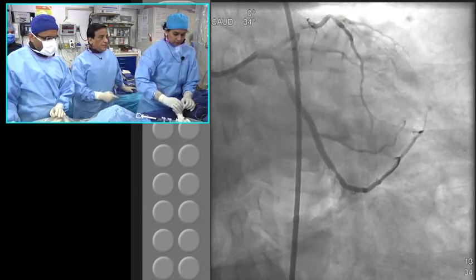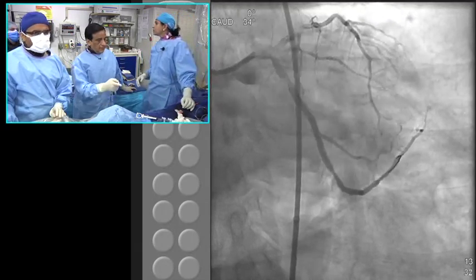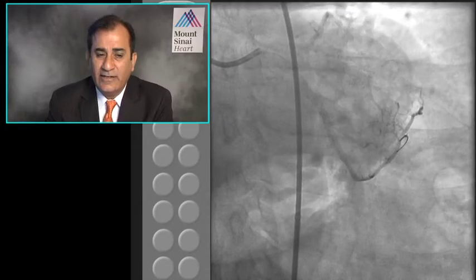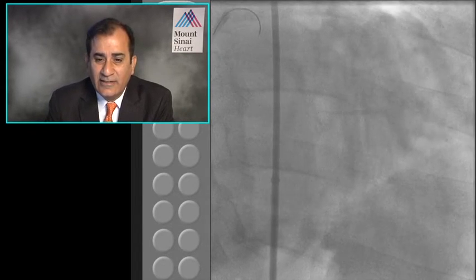But anyway, how is the patient doing? So we go to the LAD. Yeah, EKG is back to normal now. Okay, one more picture. So, Samin, based on what you presented today, what was the factor there which could have predicted the side branch?